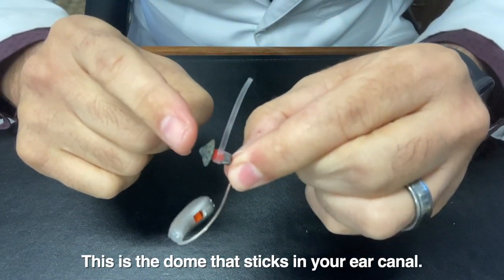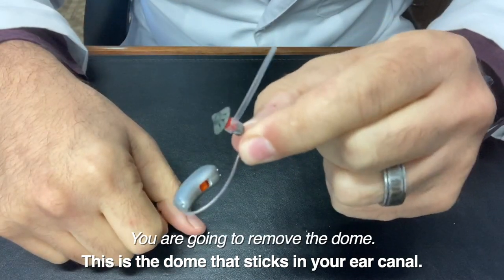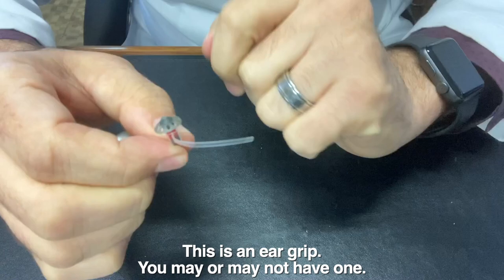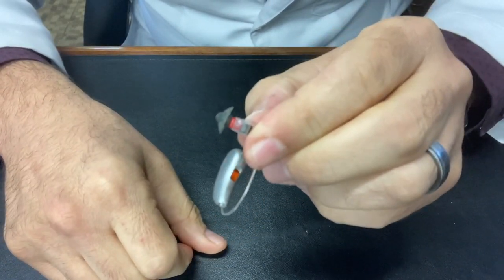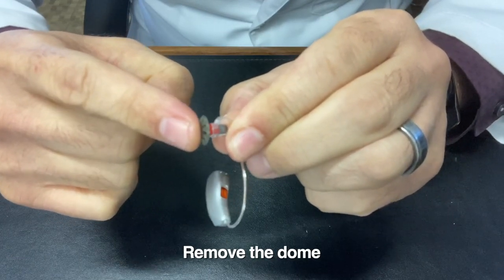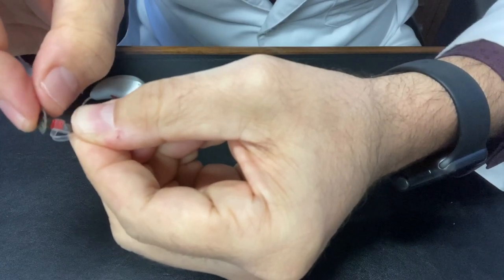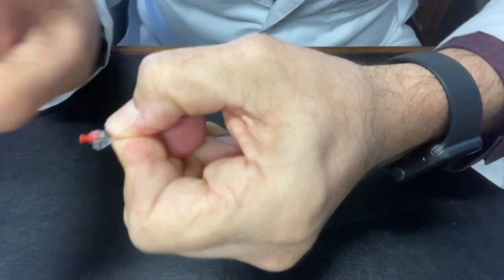You're going to take this dome off. There could be several different types of domes on your device — it might look a little different from this, but they're all removed in the same way. You may or may not have this extra tail piece on your device; if so, you can just move that out of the way a little bit. I'm going to put my fingertip right on the tip of this, then put a thumb underneath — finger here, thumb underneath — grab as much material as possible and just pull it right off.